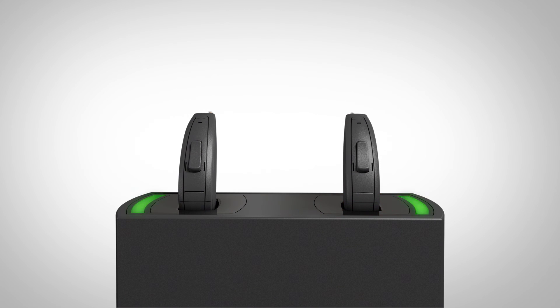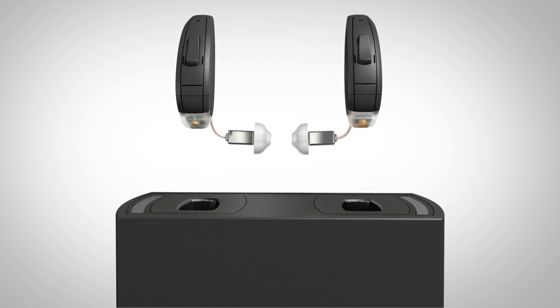The visual indicators show success: blinking green is active charging, while solid green shows a complete charge has been obtained. Patients should remove the hearing aids from the charger by lightly grabbing the base of the hearing aid and pulling up. The hearing aids will turn on automatically and be ready for use.